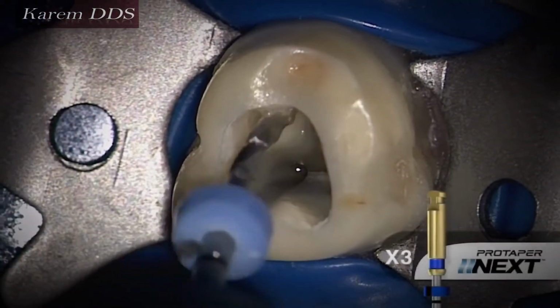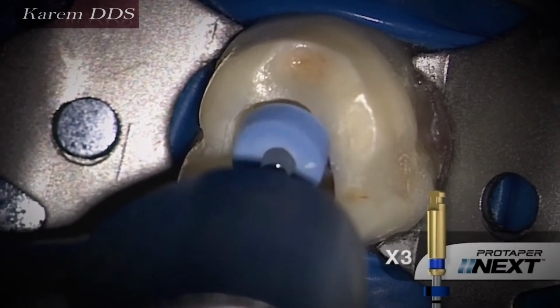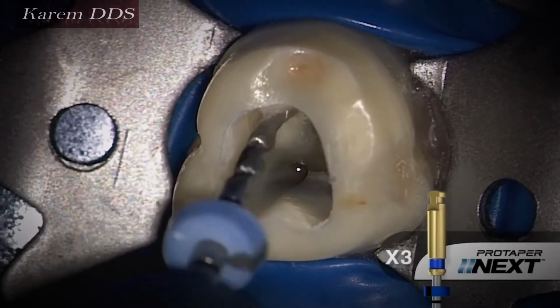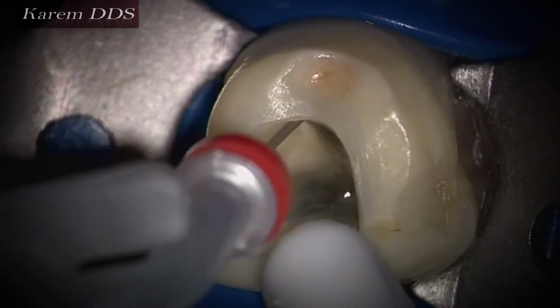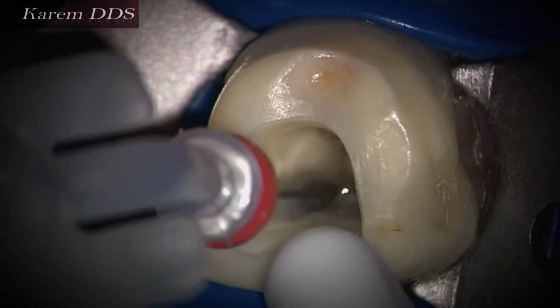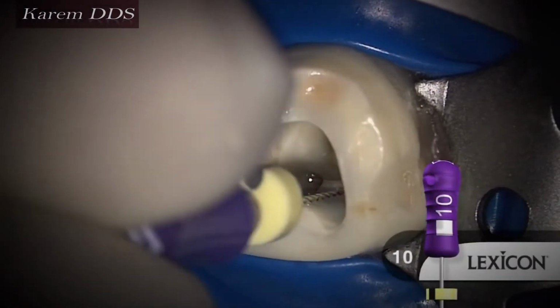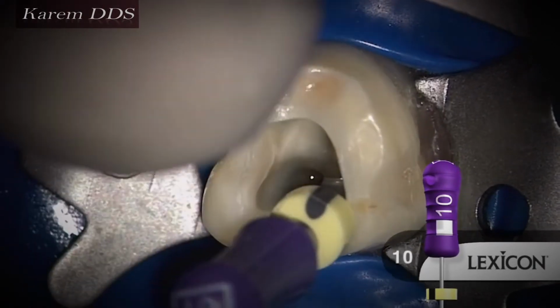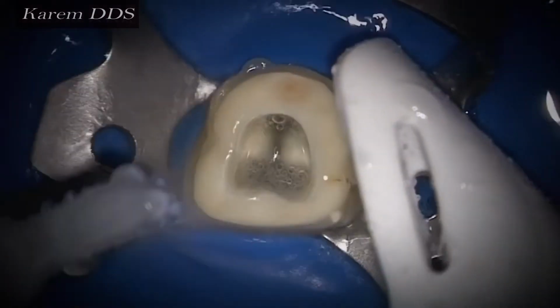Because of these obstacles in accomplishing the complete debridement and total elimination of infection inside the root canal, the goal of cleaning and shaping is to maximize the removal of necrotic and infected tissues, thereby reducing the risk of flare-up and failure of the treatment.